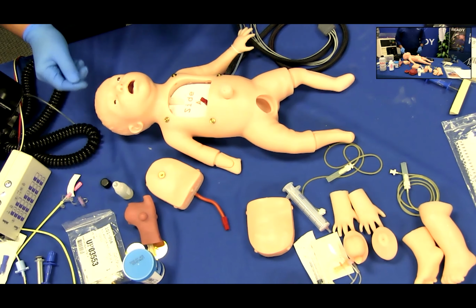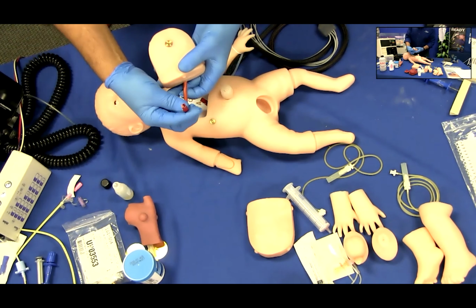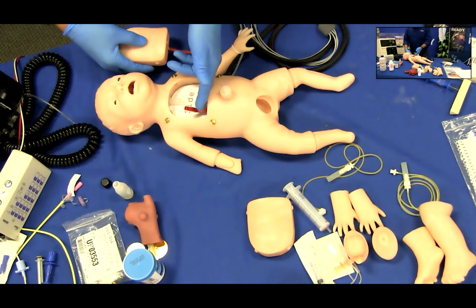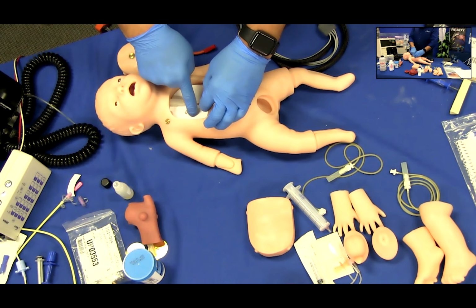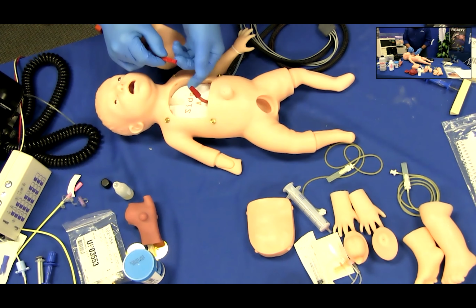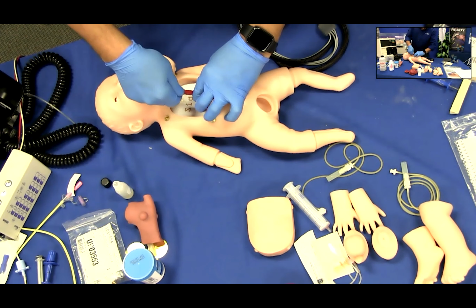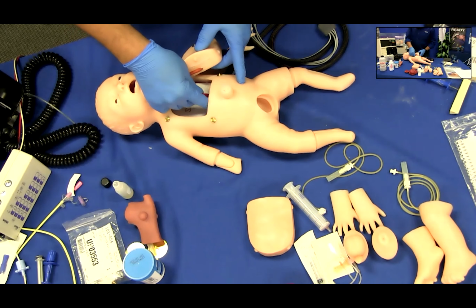To install the defibrillation chest insert and connect the interactive ECG simulator, remove the wire from under the white plate in the base of the chest cavity. Please note that the white plate is adhered to the body of the simulator and removal of the plate should not be attempted. Connect the wire from the defibrillation chest plate to the wire extending from the base of the chest cavity. Fit the chest insert back into the chest cavity.